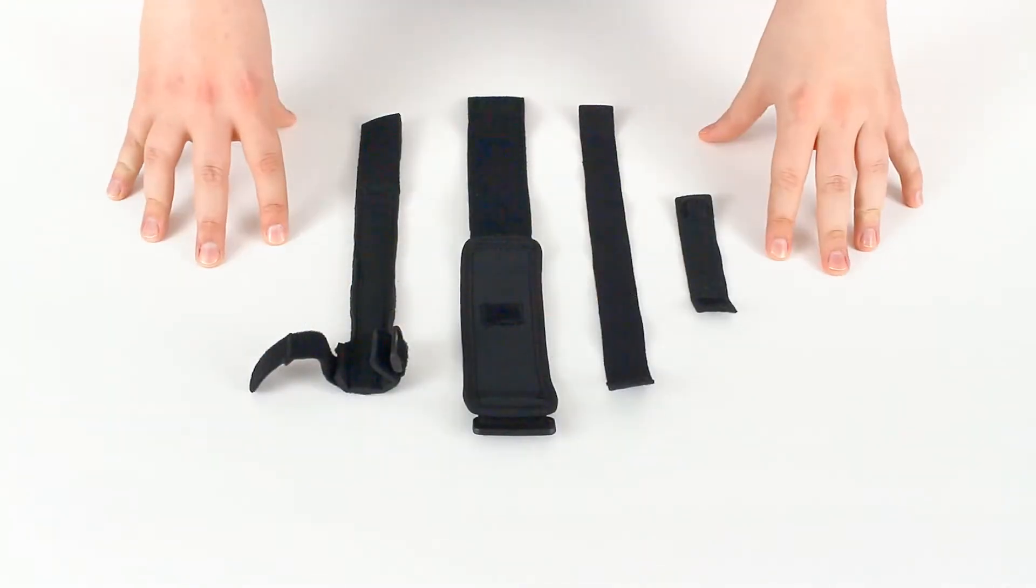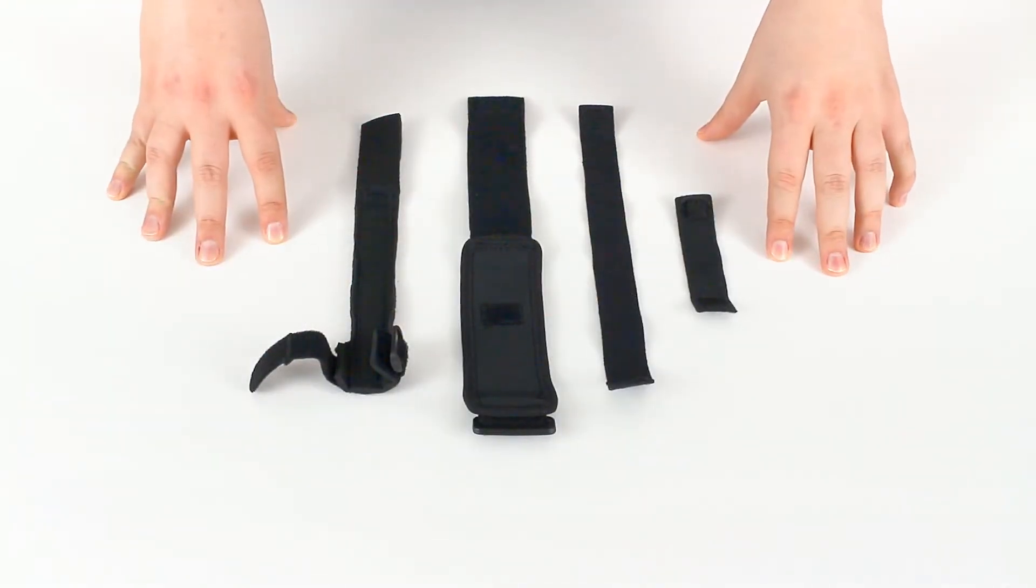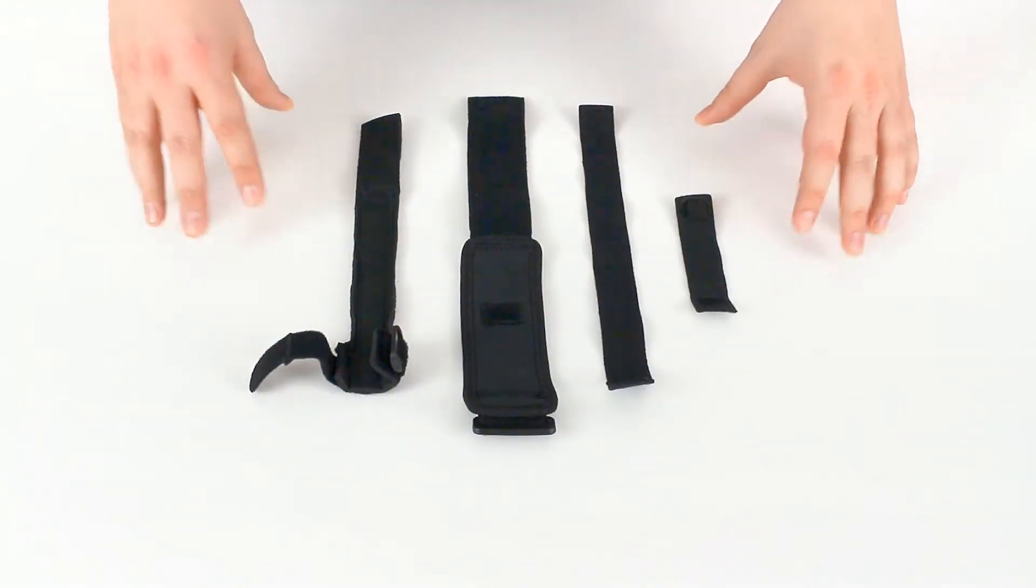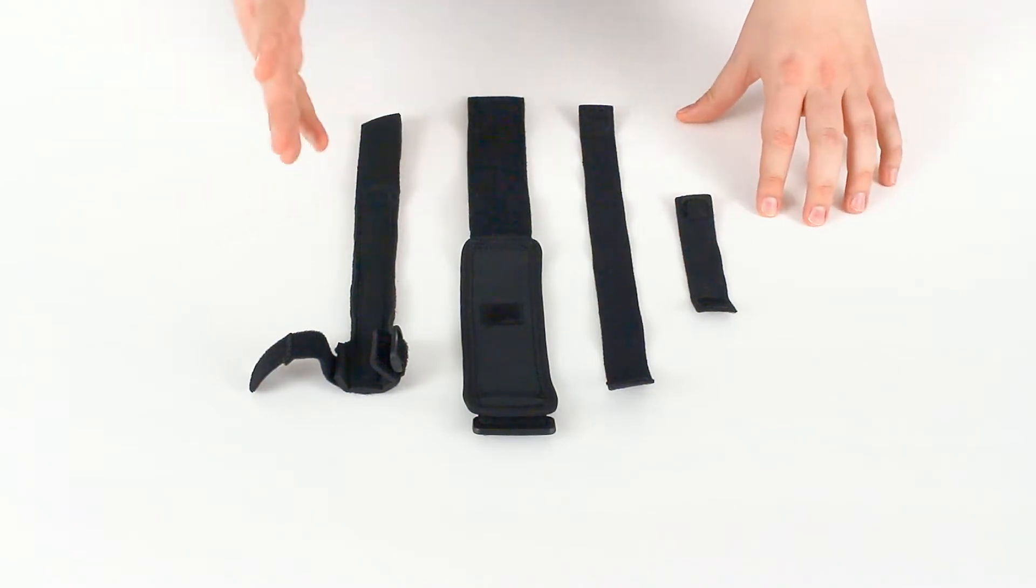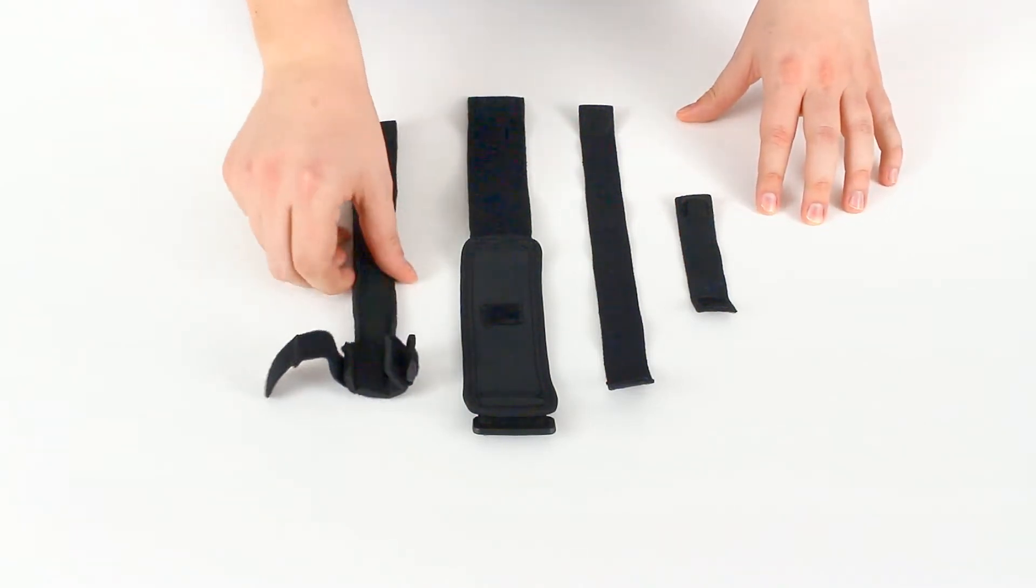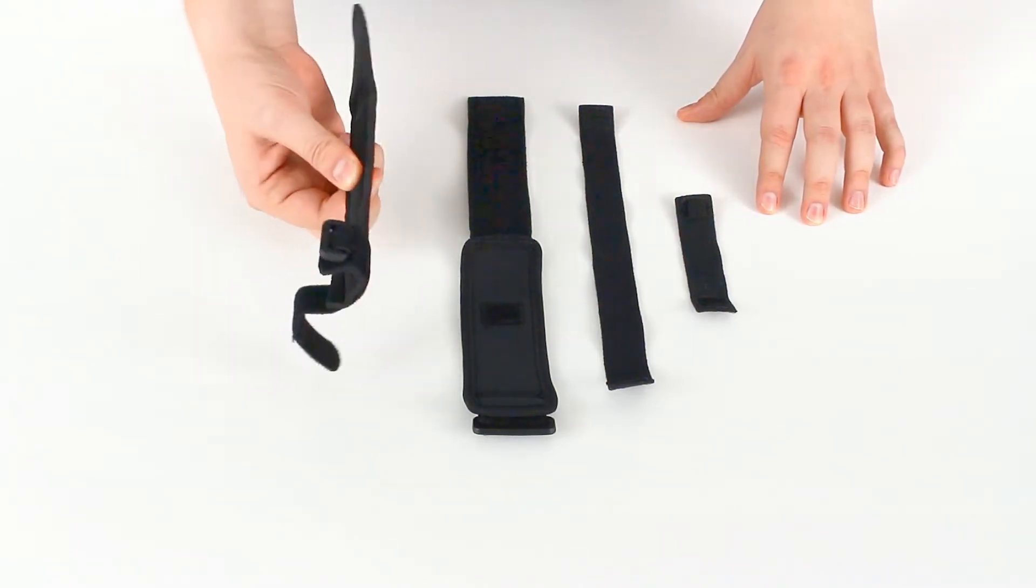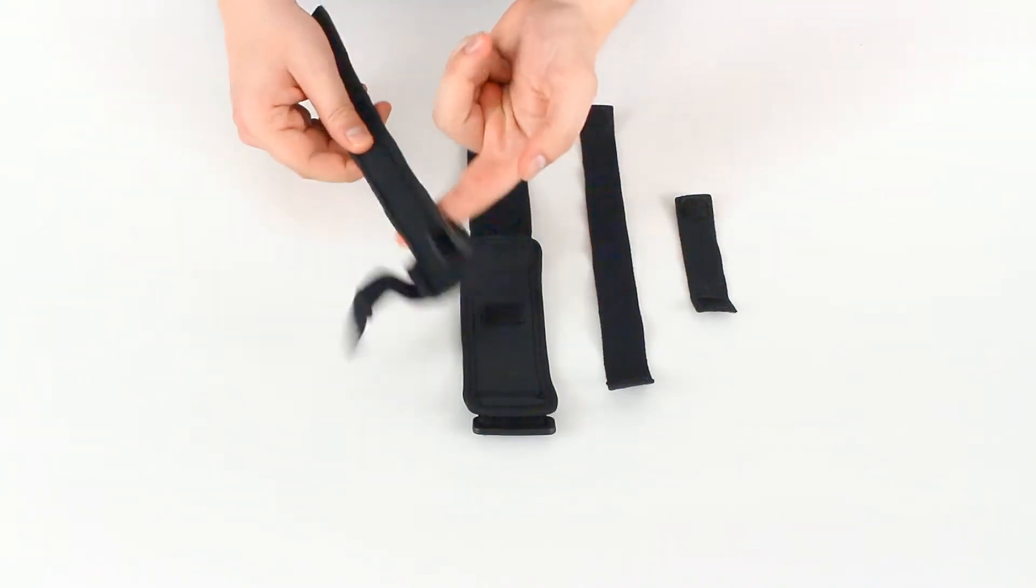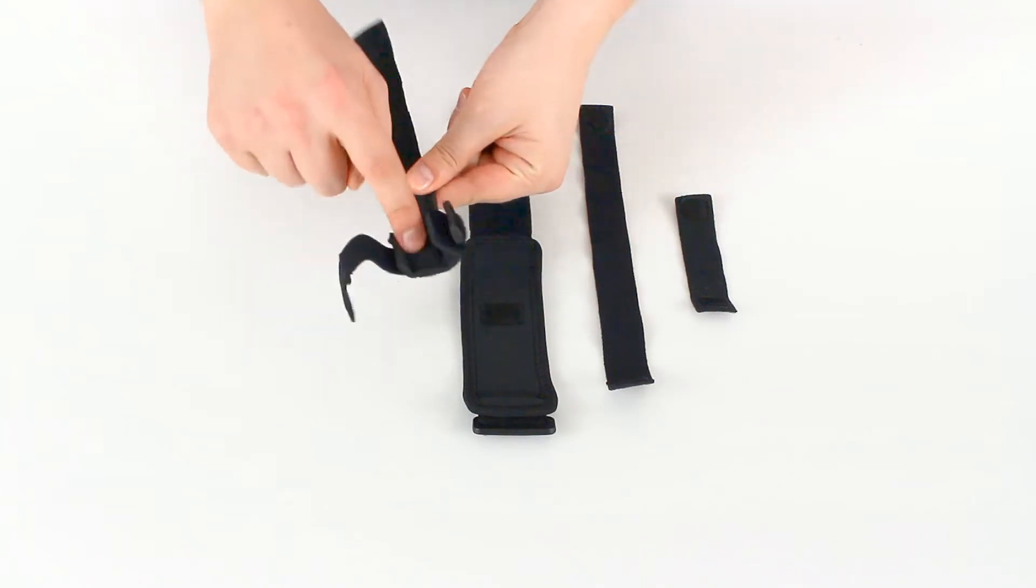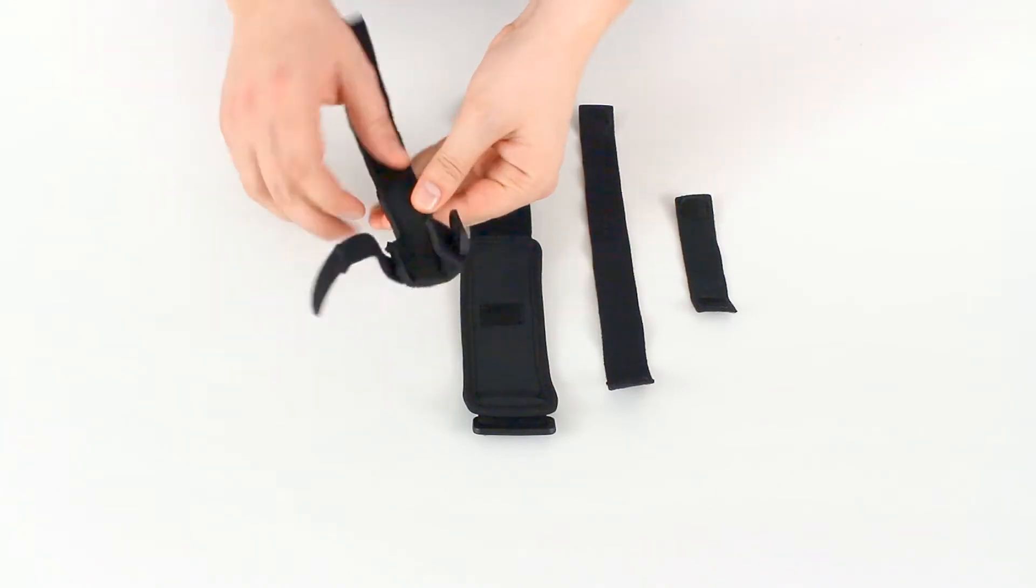So we have the full finger trigger splint broken down into its parts here. We've disassembled it. We'll start here with the actual hard splint. The splint is inside here.